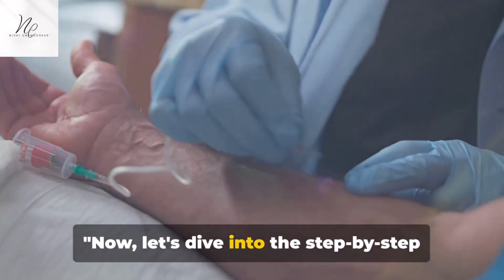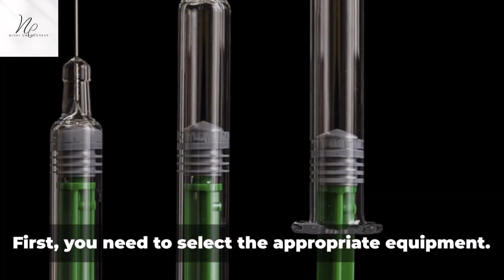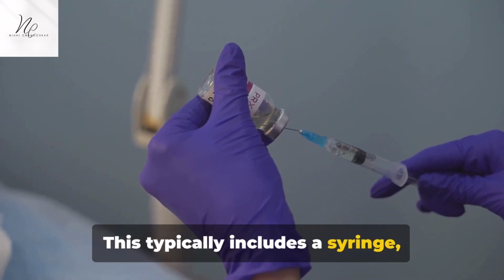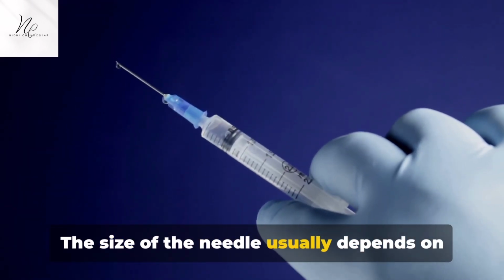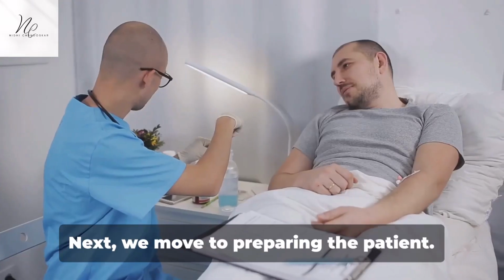Now, let's dive into the step-by-step process of administering an intravenous injection. First, you need to select the appropriate equipment. This typically includes a syringe, needle, tourniquet, cotton, and antiseptic solution. The size of the needle usually depends on the patient's vein size, with larger veins requiring larger needles.